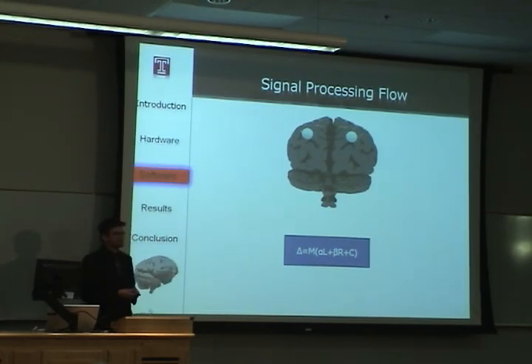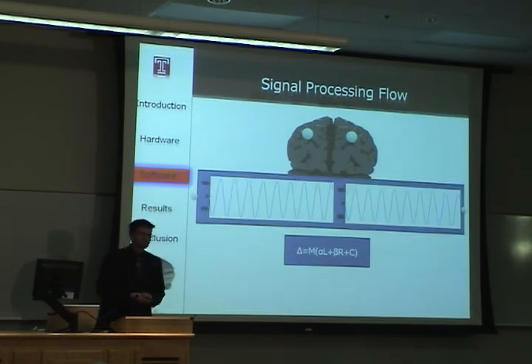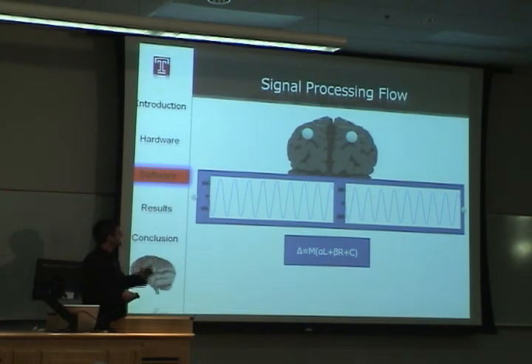We're reading from the brain signal. That signal comes out. We are given two separate signals. As I mentioned already, we're in time frame. In order to process this data, we're going to take in a window of 512 points, and we're going to actually move the window 32 points at a time. There's probably a better setup for that, but for the time being, we decided that was probably the best way to go. We just stick with one value and keep on working with it.